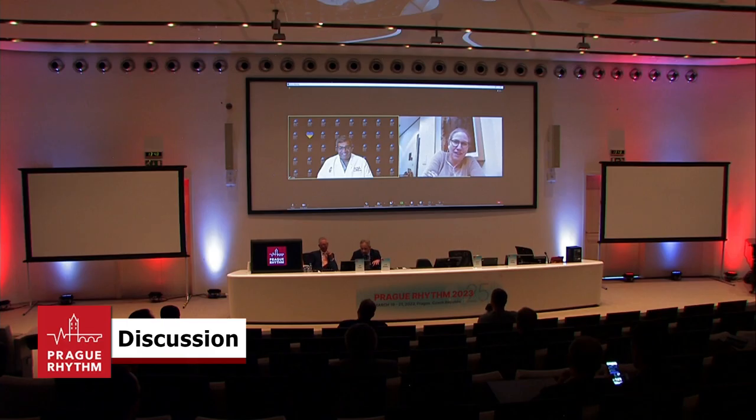That is again what we always discuss, that with pulsed field there is no class effect. You have to study every platform, every energy, every generator differently, because this is nothing uniform. This is an important message for everybody. It's not like RF or cryo, where you have a very limited number of variables we can change. This is a completely different story. But I believe, and I hope that all believe now, that we are at the beginning of a new era in catheter ablation with pulsed field, especially for complex arrhythmias like atrial fibrillation and ventricular arrhythmias.